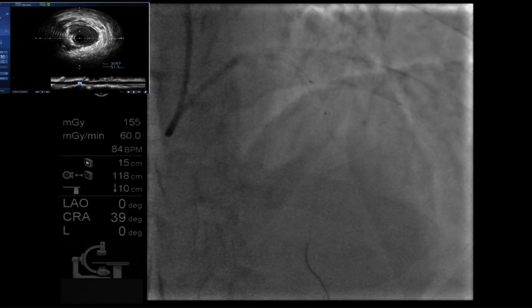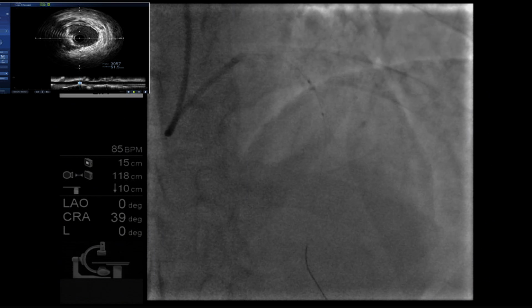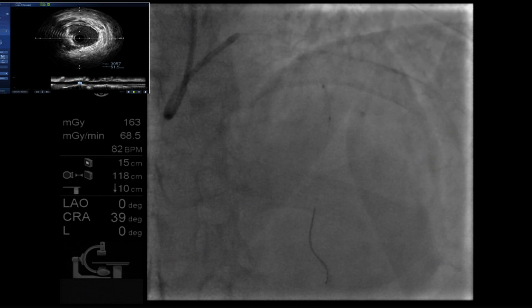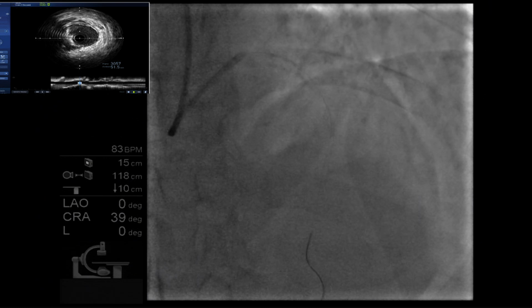Do you make much use of the virtual histology information on IVUS or not in your cases? Virtual histology, okay? 3 by 28. You agree with 3 by 28?